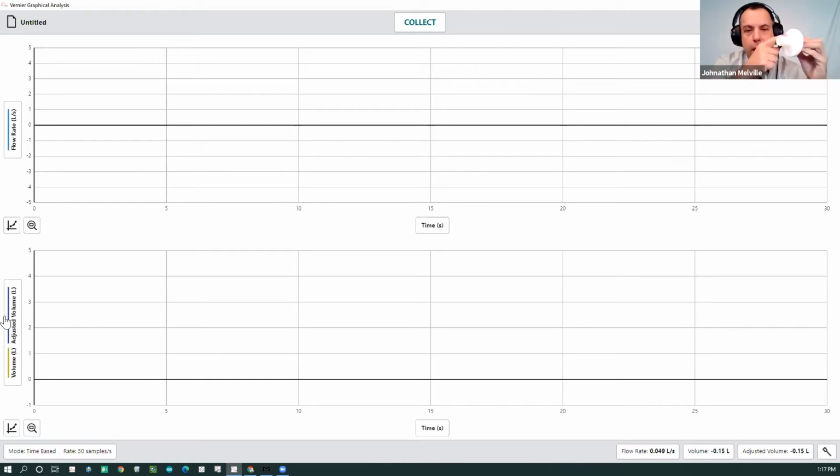If one student wrote their name on it, they could reuse it. I do know people that do that. They'll take this, put their name on it, put it in a plastic bag, and then it's that student's, and they use it when they're doing the experiment. But they cannot be shared. The reason that's really important is, I have people that say, oh, we're only going to exhale out of them. I would normally say, that's great, but you don't want to risk that. If another student puts their mouth over this and exhales and then just inhales, they're going to expose themselves to whatever the other person was breathing through it. So it's basically one per person.